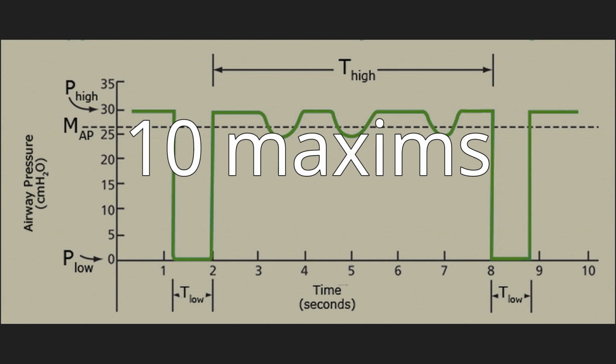The targeting schemes can be represented by single, lowercase letters: setpoint equals s, dual equals d, servo equals r, biovariable equals b, adaptive equals a, optimal equals o, intelligent equals i. A tag is an abbreviation for a mode classification, such as PC-IMV,s. Compound tags are possible, for example, PC-IMV,oi.